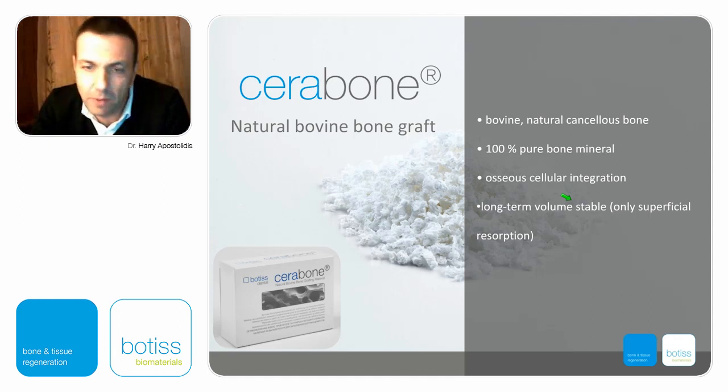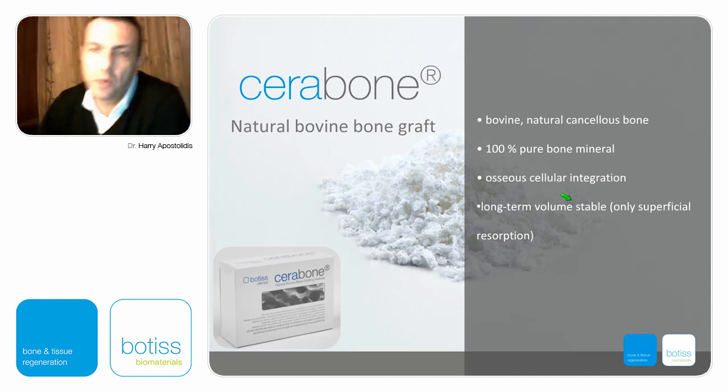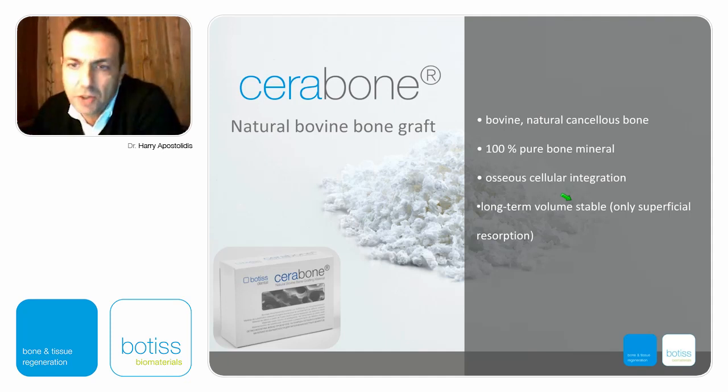But when you build outside the bony envelope, then you have to rely on your bone graft to stay there forever. So you don't want to use an alloplastic material. You don't want to use an allogenic material. You're going to use autogenous bone graft with xenogenic particles that give volume stability.